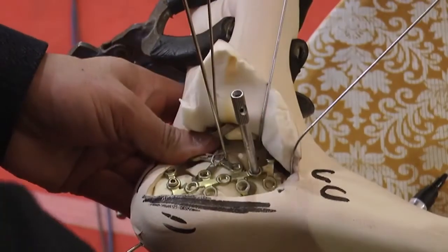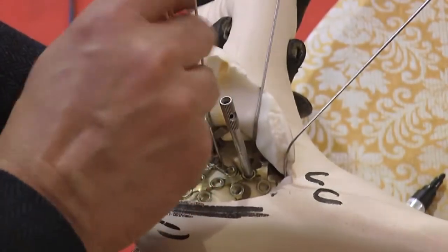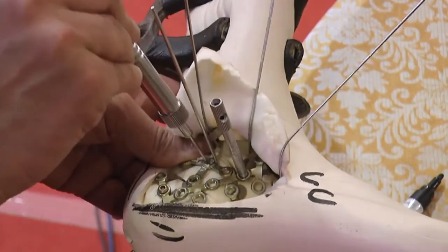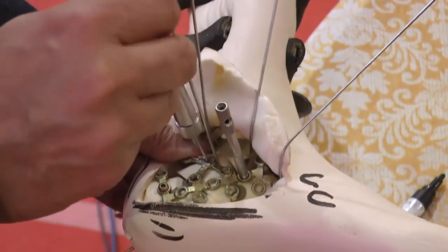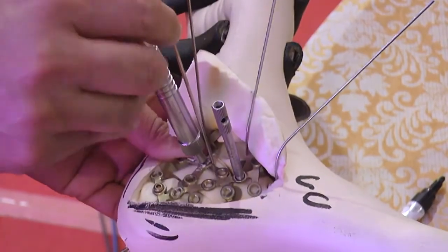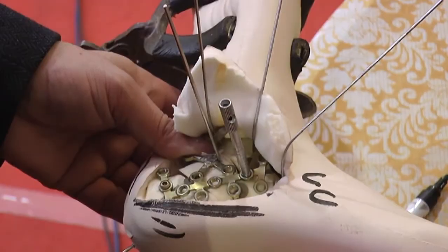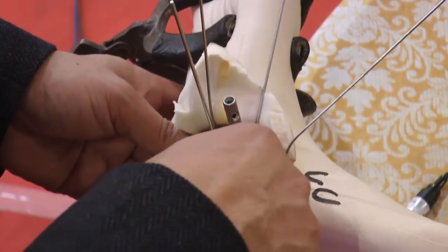In the C-arm, if you've gone about 1 centimeter, you can take an axial and see the direction in which you are going, rather than going all the way and then taking a shot. So you start the drill bit and you take a shot. This is 35. And then obviously you will put one cortical screw in the anterior process.